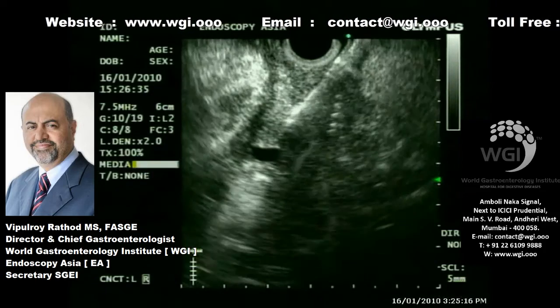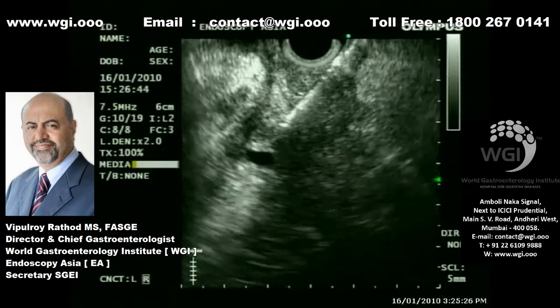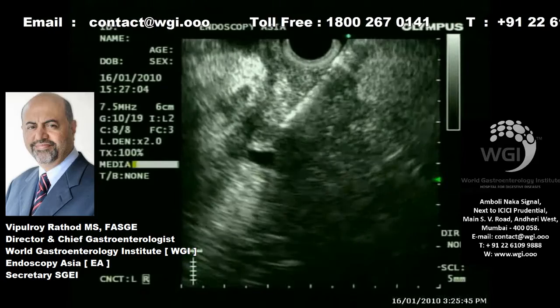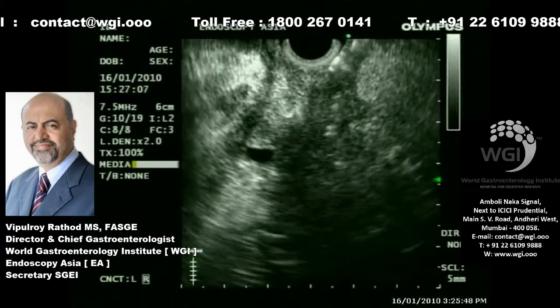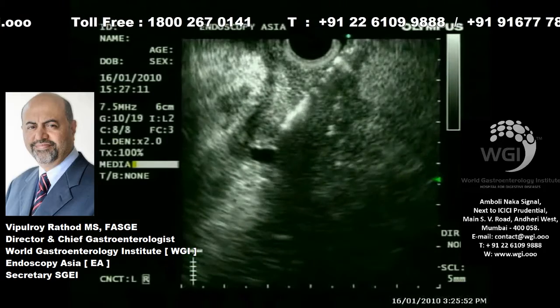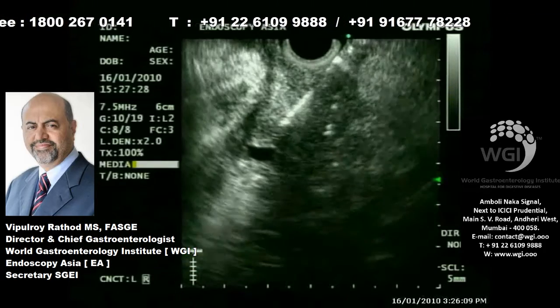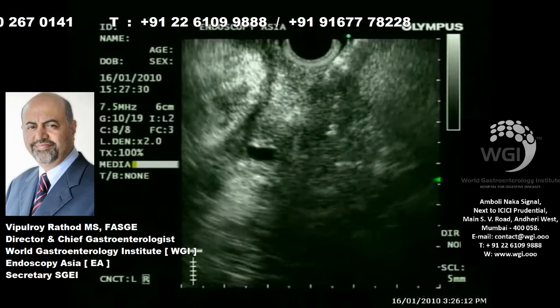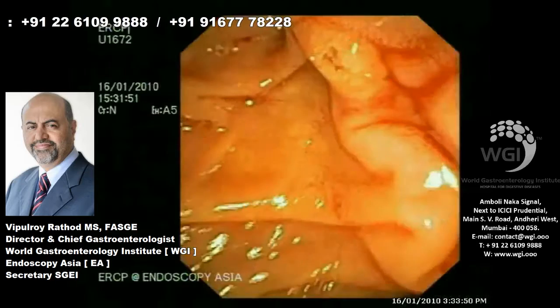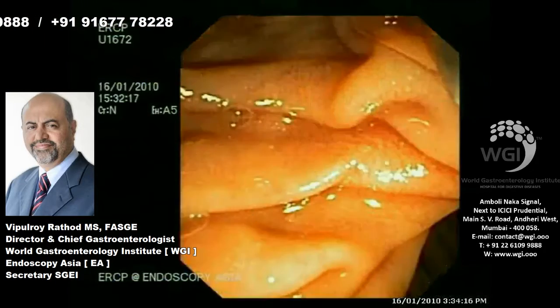It's our standard technique over the last 7,500 FNAs that we have done and learned lessons from, that there is no need to wriggle your needle very aggressively in the lesion, because that can lead to a lot of blood. So very gentle to and fro maneuver of the needle within the tumor up to the periphery of the lesion. We stay there for about 30 to 45 seconds, and that's the end of the procedure. This is enough material we have aspirated out of the lesion.